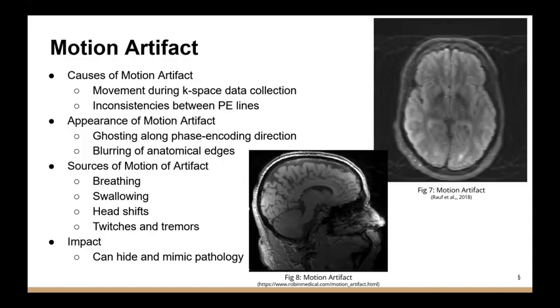Clinically, motion artifacts are important because they can hide subtle lesions, distort anatomy, or even mimic the appearance of disease. This often leads to repeat scans and reduced diagnostic confidence, which is why understanding and correcting motion artifact is so crucial.